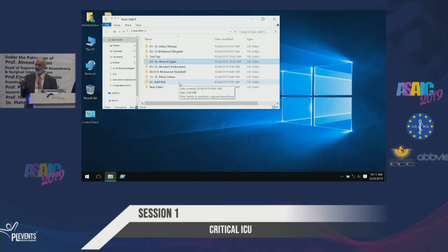And the breath cycle, if the patient started synchronized with that, okay. If the patient did not start, it will start, and the cycle will wait for 90% of the time to deliver the breath. If the patient took his breath, it will deliver to be synchronized. If not, this needs some explanations on the waves, okay? But this is the cycling for the synchronized intermittent.